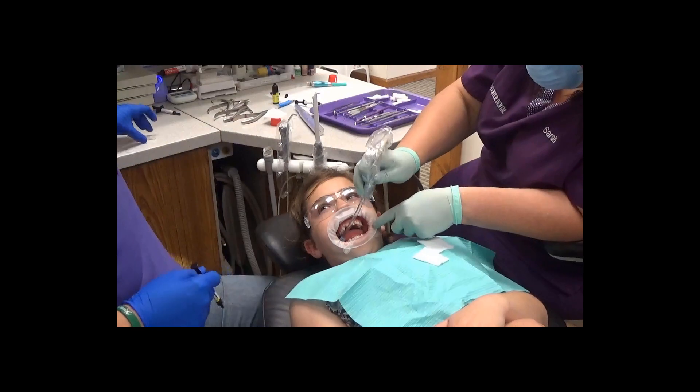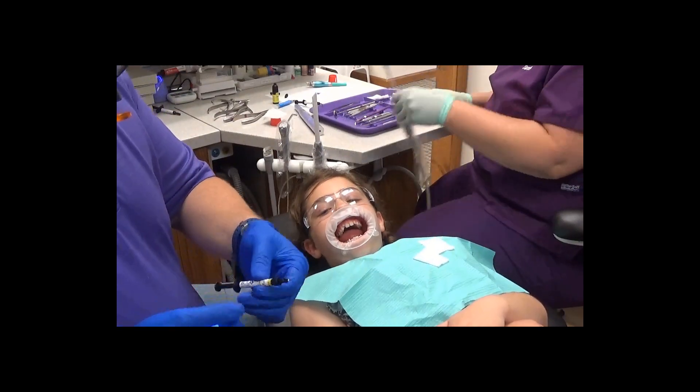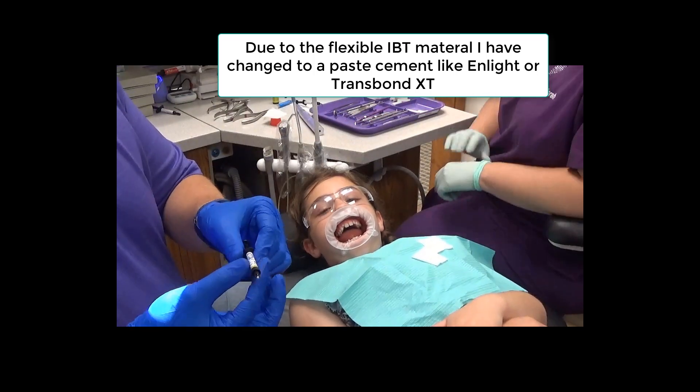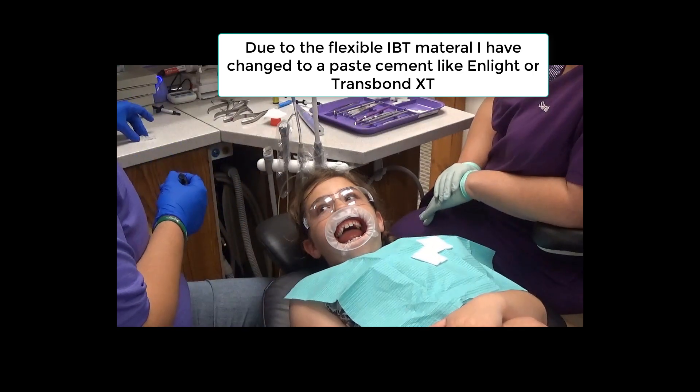Now we're going to start with the upper right. When doing indirect bonding trays, I like to use a flowable cement. Here we're going to be using Floatain by Reliance, if I remember correctly.